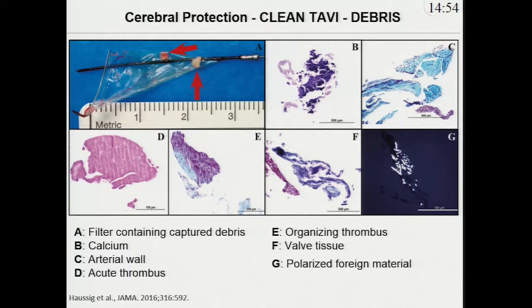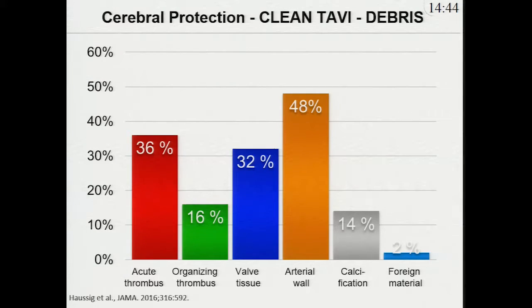So we're dealing with many different forms of foreign material which has to be taken into account when we're trying to protect the patients from this complication. These materials do not usually stem from one single source, but come from various different sources, and usually it's a combination of locations and a combination of the different types of materials which we find in this area.